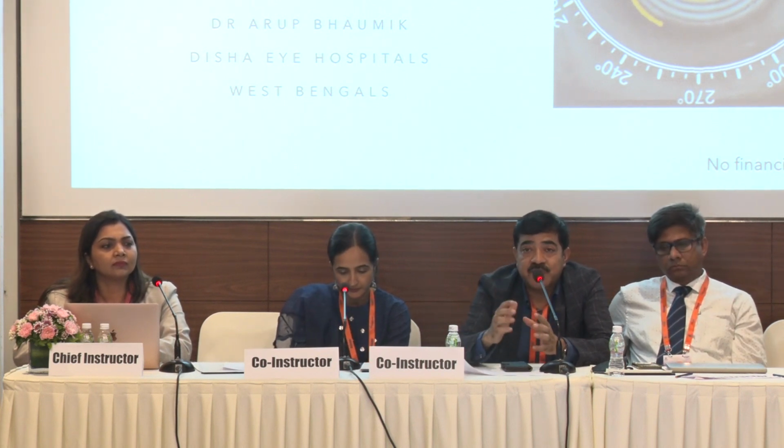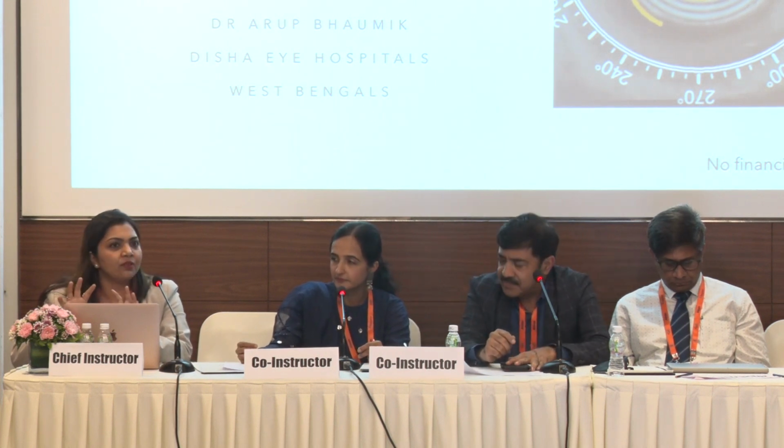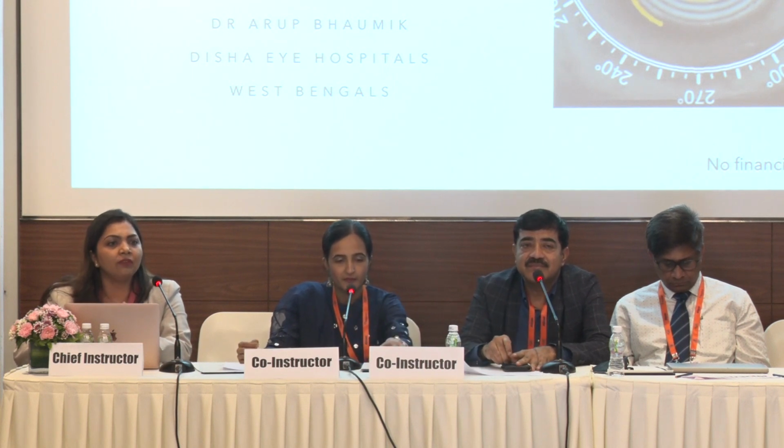See, the idea of patching, especially in these high myopes, is that the lens is sitting in your bag as the eye forms up. So the idea of patching is to keep the eye at rest. With any stress, when the patient gets up and walks, there would be a little bit of forward and backward movement, so that could rotate. There have been instances in a myopic eye, anything below 18 or 19 diopter where I'm putting in a toric, where we've seen rotation in the first 24 hours. So it's ideal to limit the movement of the patient in the initial 24 hours.